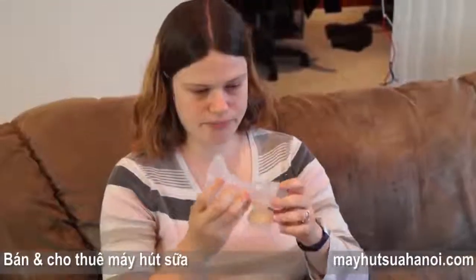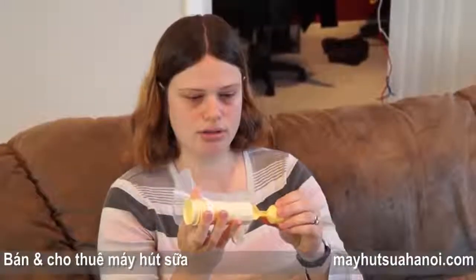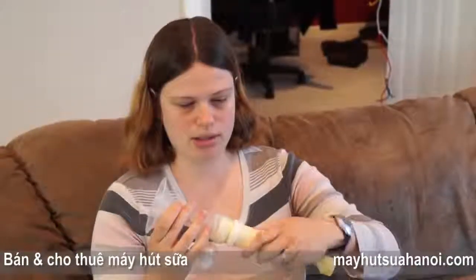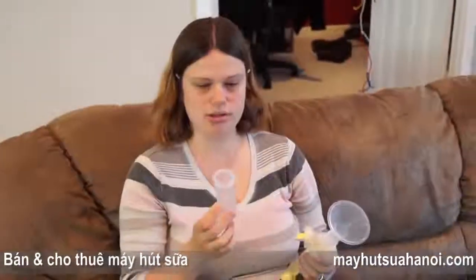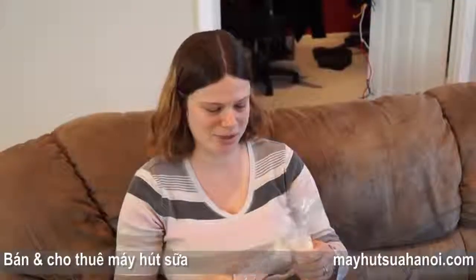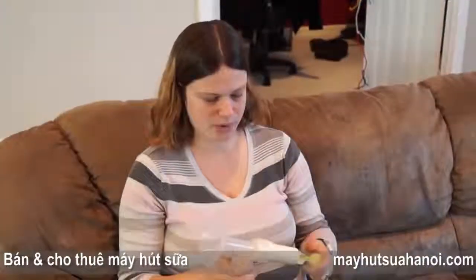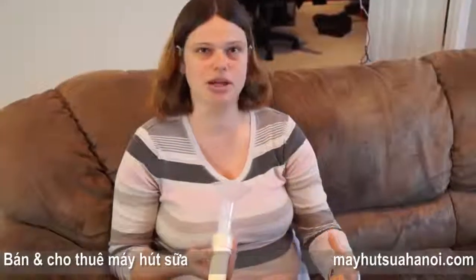Attach the flange here. This is the part that actually does the pumping. Attach that to the back, screw it on. And then you attach a bottle to the bottom. This is a little 2-ounce bottle that they gave me in the hospital. Obviously, if you're pumping more than 2 ounces, you're going to want a bigger bottle. Screw it on. And pumping is really basic. Basically, you're just creating a vacuum and sucking the milk out of your breast.